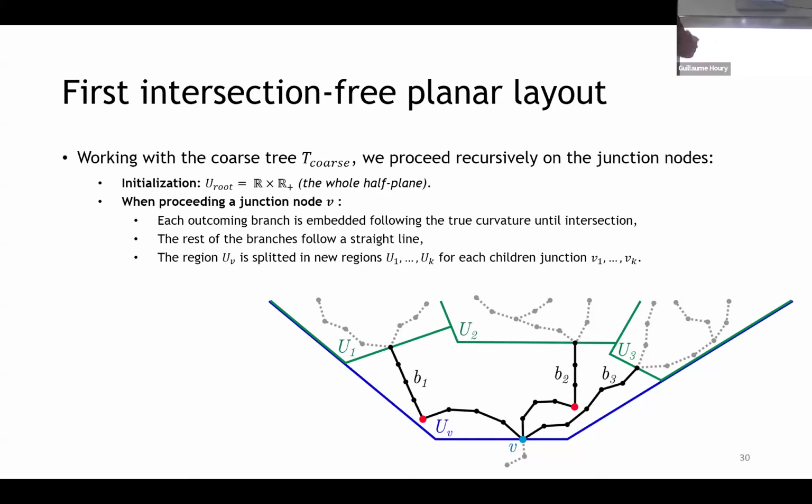Maybe a remark, I don't know if we're going to discuss it at the end, but I think what's really interesting in this field is that depending on the intervention that you're making, you're going to prioritize or preserve some aspects of the 3D geometry in the 2D visualization. For instance, Guillaume briefly showed visualizations that are tailored for interventions with needles. But here it's tailored for interventions with catheters, like endovascular interventions. So you know that you cannot fully preserve the curvature and length.